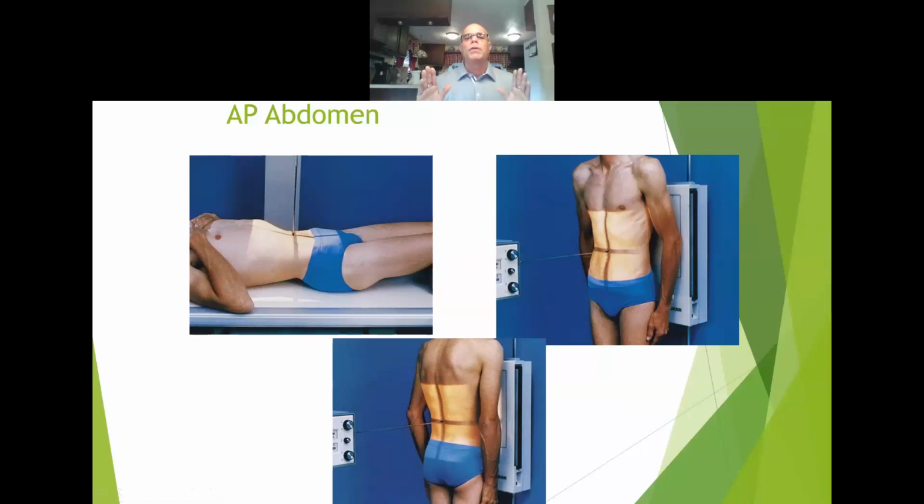Different people have different thoughts about this. I'm a medical professional. I palpate. I touch. I warn people I'm going to do it. I've never had a problem in my 30 plus years doing this because I'm a good communicator. I tell exactly what I'm going to be doing. I ask for permission, especially with children. I want them to know what I'm doing. I want the parents to be aware of it, because the worst thing that can happen is the parents aren't in the room with you, and a little child goes out and says, "Mama, that guy touched me down there," or whatever. That's not what happened.